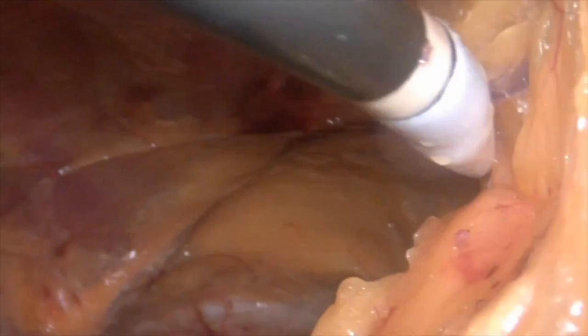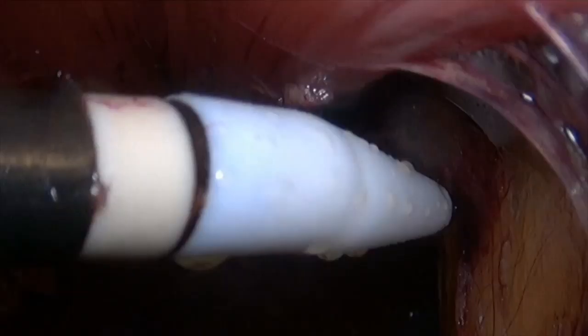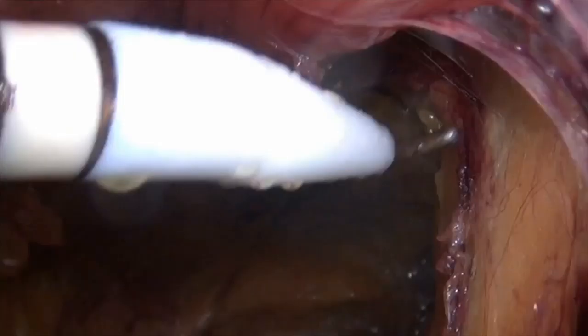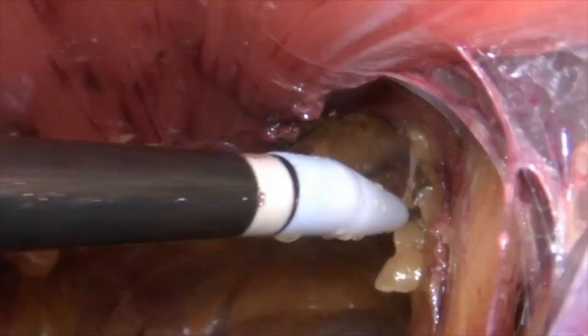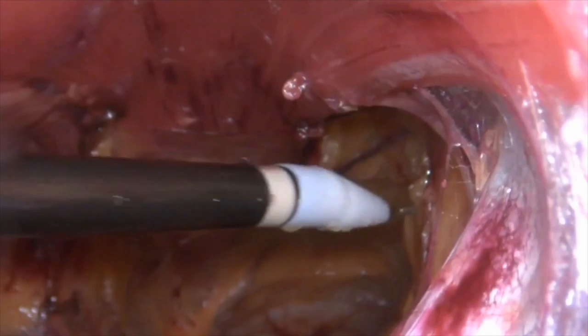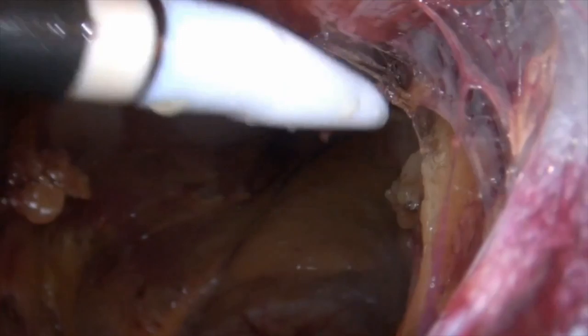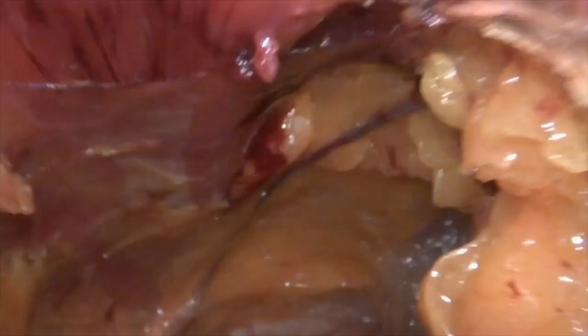In e-TEP, it is even better visualized, and I've deliberately selected this case so that the fat is more, and you can see how much dissection is really required sometimes to put the working port, the second working port. So here you can see we're just using the cautery once again, and we're doing the dissection in a sharp manner. We have to take care that we don't dissect too much lower, then there's a possibility of injuring the peritoneum and causing buttonholes to it.